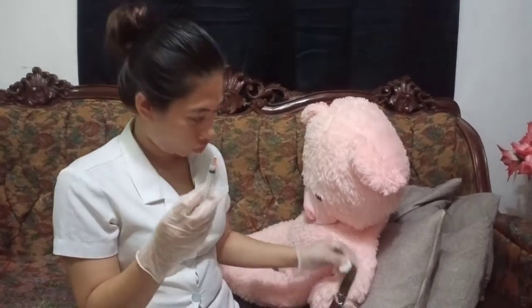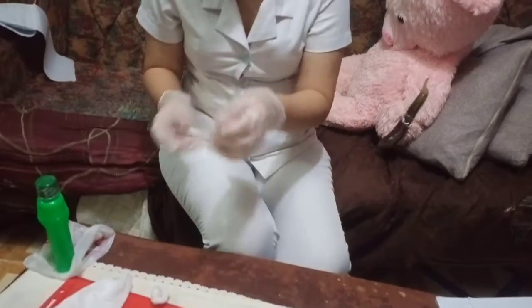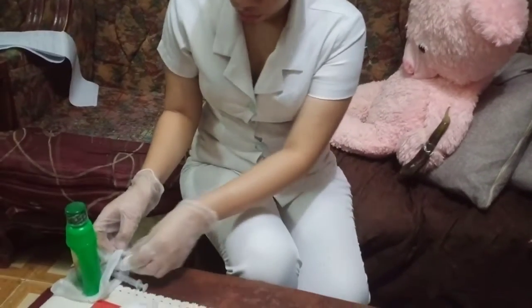Then activate the needle safety device or discard the uncapped needle and syringe into the proper place. Then, remove and discard the gloves and perform hand hygiene.